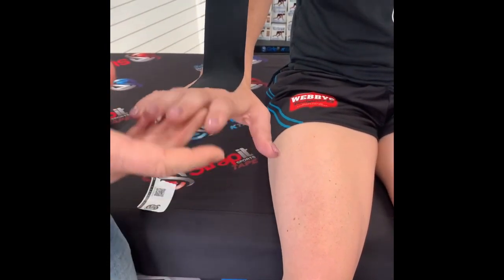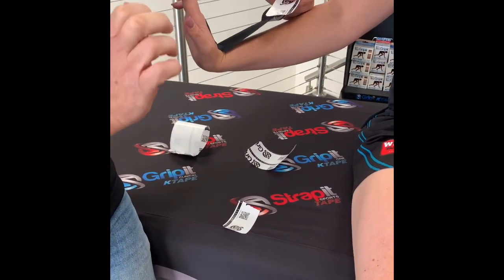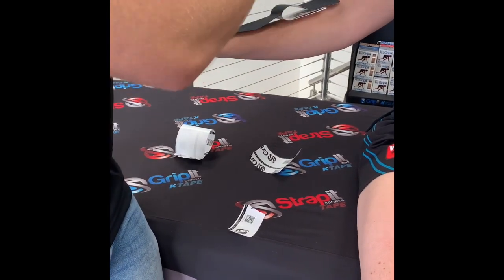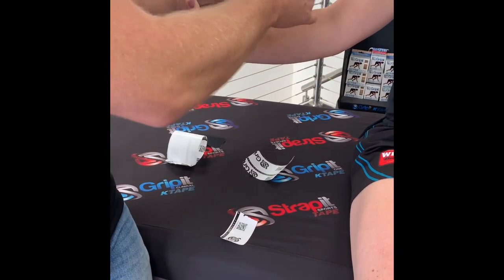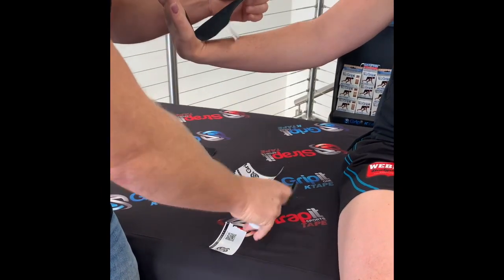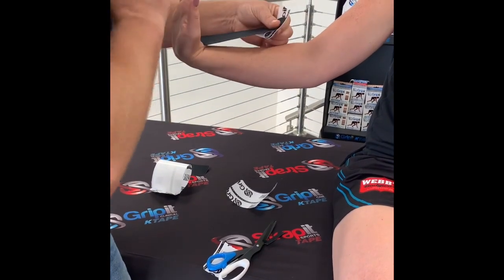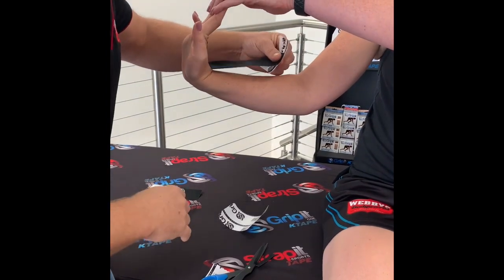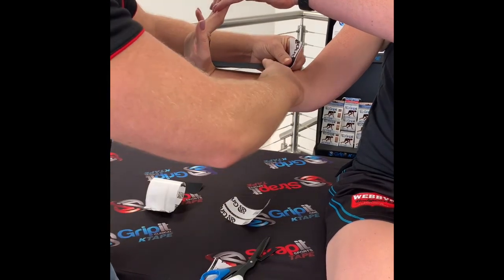Right, now, like the principles of active taping, you'll make sure the joint is on full extension in the shortened position, okay? When we put the tape down, we're just gonna round this off a little bit earlier because it's a little bit long. Okay, so now, knowing that again that the tape has a memory, we have Amy in full extension. Yep, she cheated there a bit. You got to make sure you sometimes ask your patient to put their other hand on the fingers here, just to keep that in full extension so you know you've got that commitment there from the patient. And then again, just take up the slack.